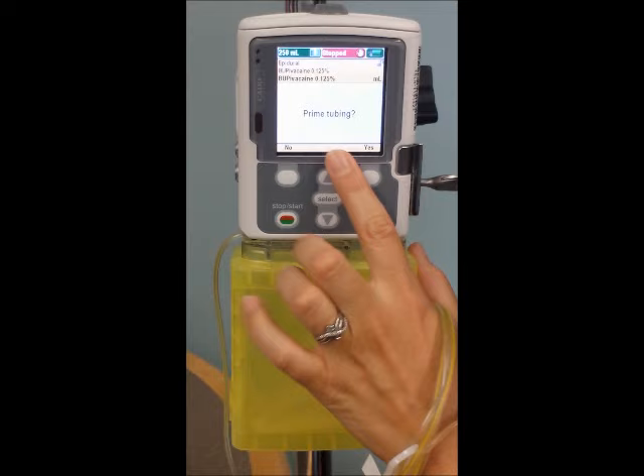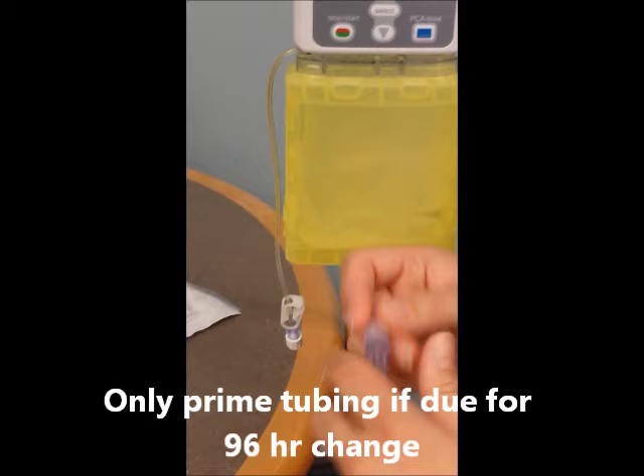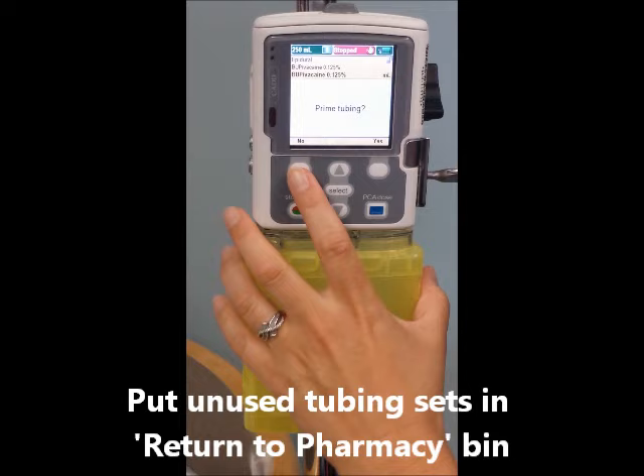After changing the reservoir volume, the pump will ask if you need to prime the tubing. In most cases, you will not, unless the 96 hours have passed and you need new patient tubing. If that would happen, you'd connect the new patient tubing to the pigtail and choose yes. As I said though, in most cases, you will choose no.